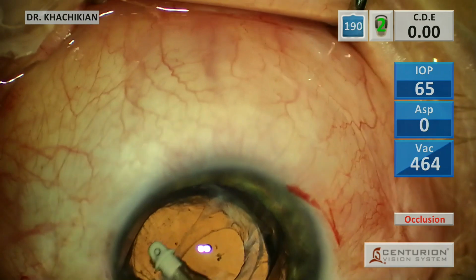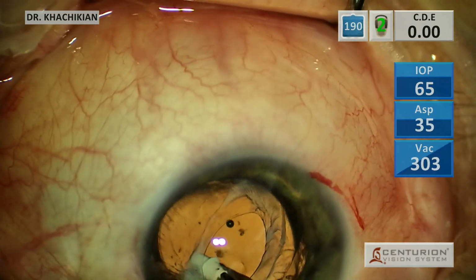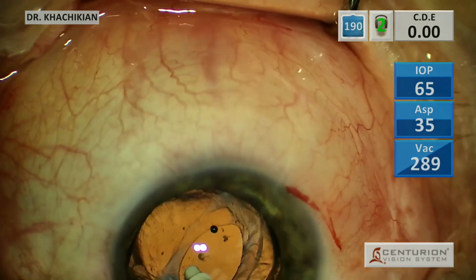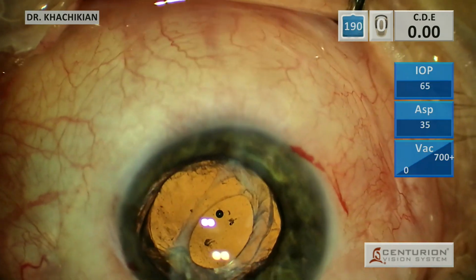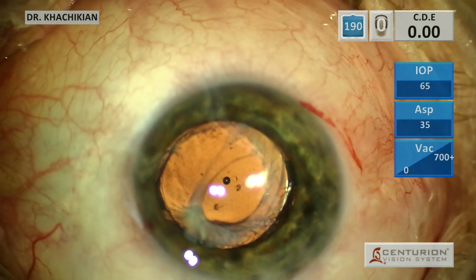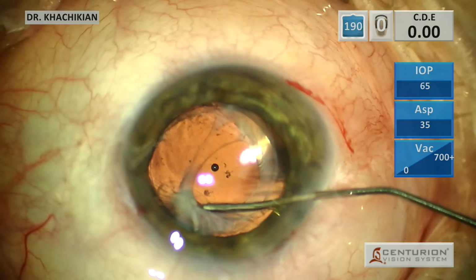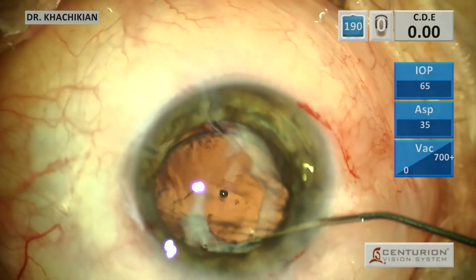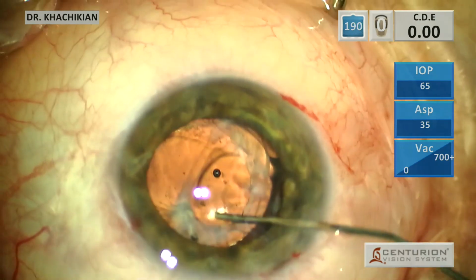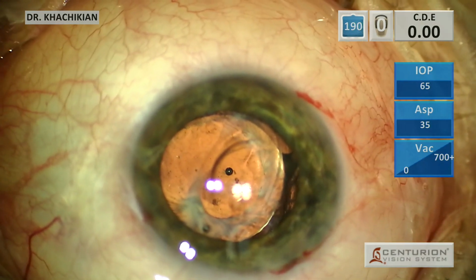And the more of this scar tissue you can remove, the more relaxed that capsular bag will become, and the less likely this will be to reoccur. You can see one of the haptics is just kind of stuck in that phimosis. Maybe we can free that up. And this is where we'll go back in with some viscoelastic and try again. Where focally is the problem area, and let's try and free it up. And you really have to go back and forth a couple times, especially when there's all that retained cortex.